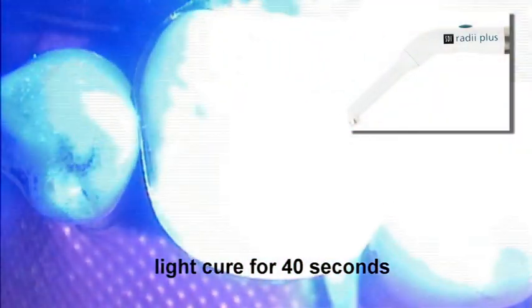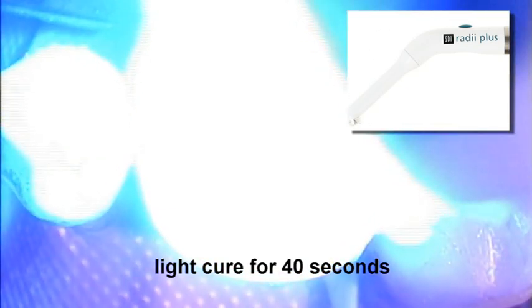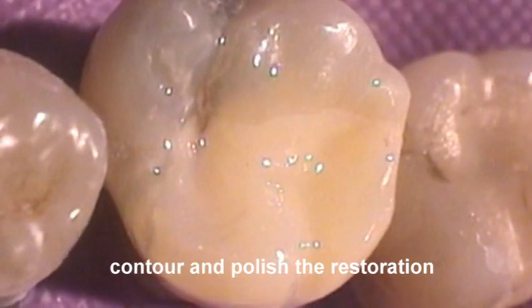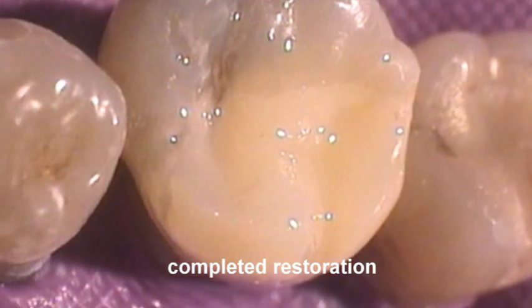Light cure the restoration for 40 seconds to enable the exothermic setting reaction of the composite resin to help set the Reva SC. Contour and polish the restoration with suitable rotary instruments. Completed restoration prior to occlusal adjustment.